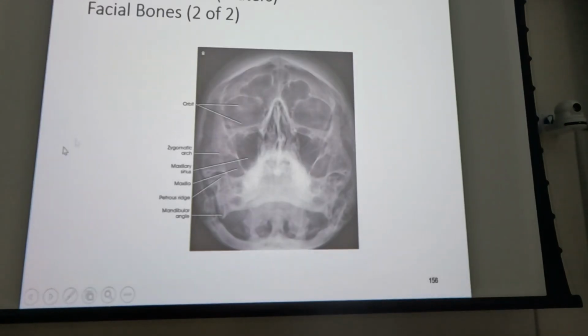Yeah, you see the maxillary sinuses. So what do you suppose your go-to view is to see the maxillary sinuses? Yeah, 37 waters. Let's see. Can you see the frontal sinuses? Yeah, you can see them quite well.